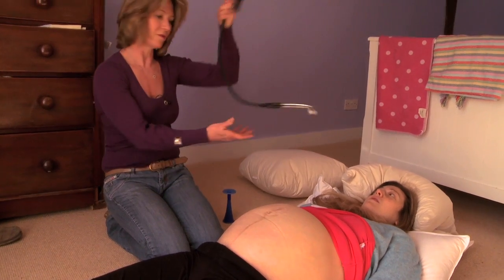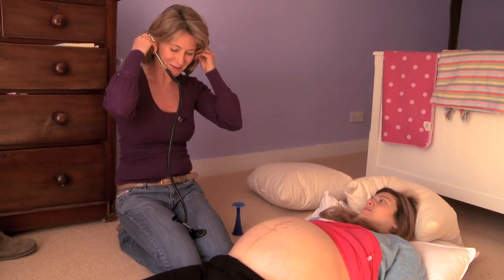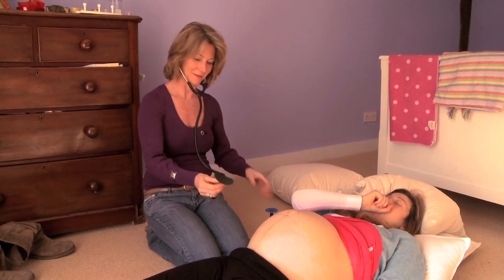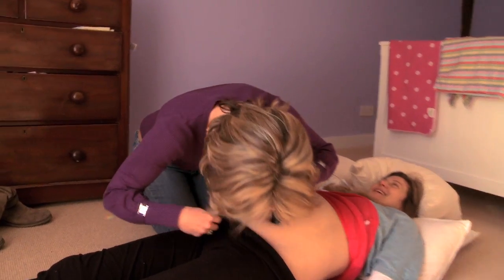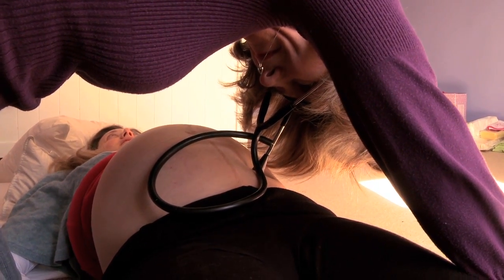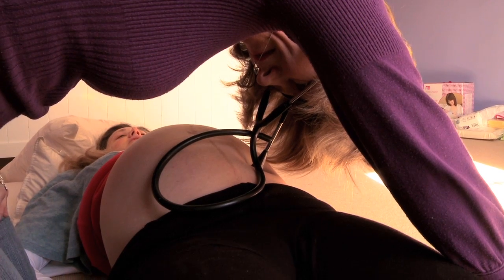I'm also going to use this as well. This is called a fetuscope. Remember I used this a few weeks ago as well? It must be a bit funny when I use this though — it looks a bit daft. It's just like this, but it goes in the ear, so I've got to brace it against my forehead. That's excellent. So that's to hear the heartbeat as well, is it?